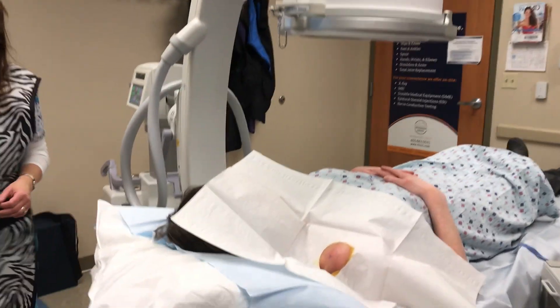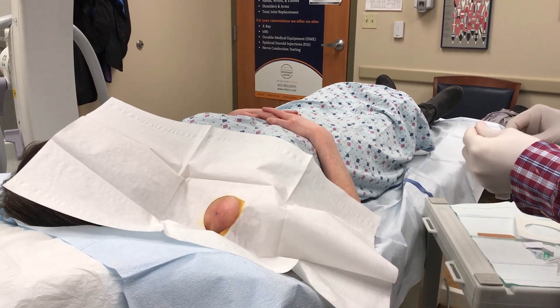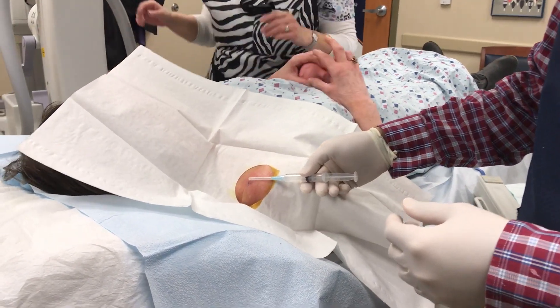We're going to pan over to the shoulder. We have the patient's AC joint sterile prepped here. We'll mark the area here, then x-ray.